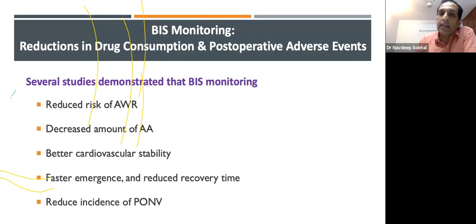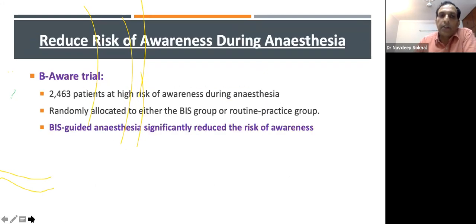Now, several studies have demonstrated that use of BIS monitoring for depth of anesthesia will reduce risk of awareness, reduce the amount of anesthetic agents used, give better cardiovascular stability, faster emergence and reduced recovery time, and reduce incidence of postoperative nausea and vomiting. So these are the benefits.